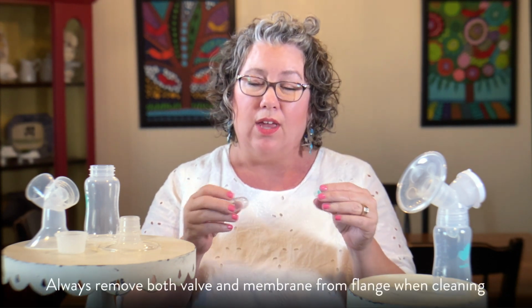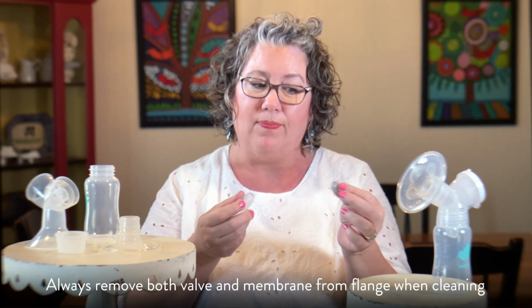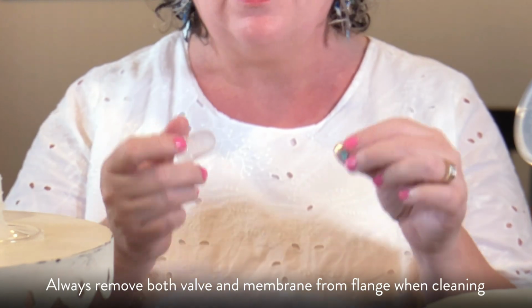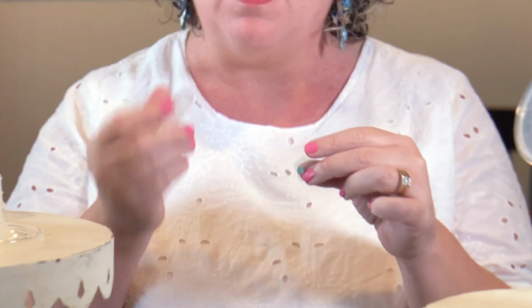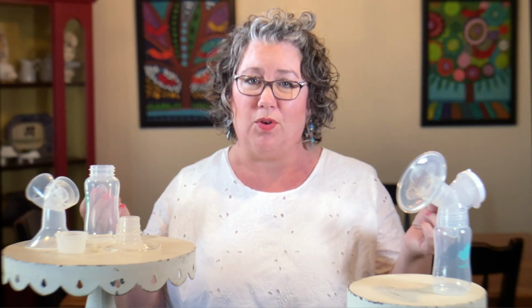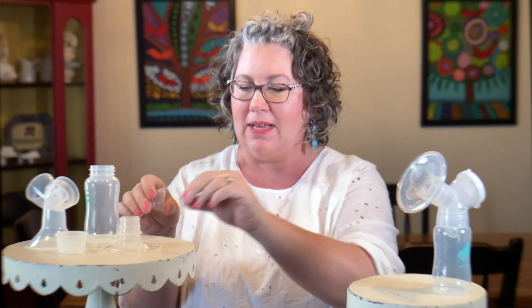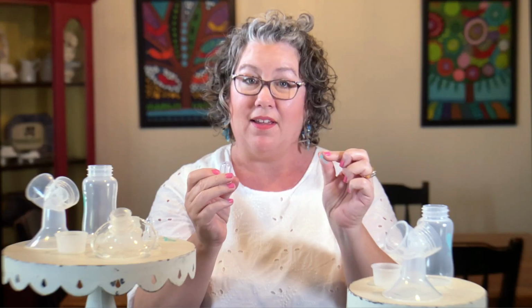So every time you pump, when you're finished and you're ready to clean your pump, you need to remove the membrane from the valve. This is the part that milk flows through when you're pumping. If you forget to remove it and clean it, eventually the milk dries and seals the membrane to the valve, and then milk won't flow through your pump and your pump stops working. So always remember to take the little green piece off. And that's it. Let's do the other side. Okay, so these parts are ready to clean.